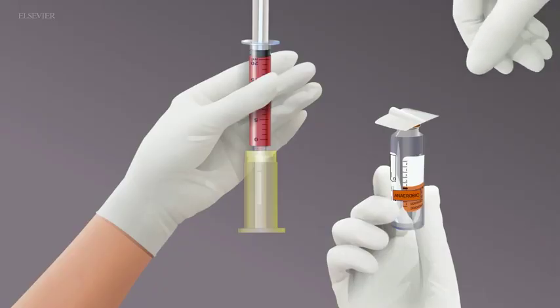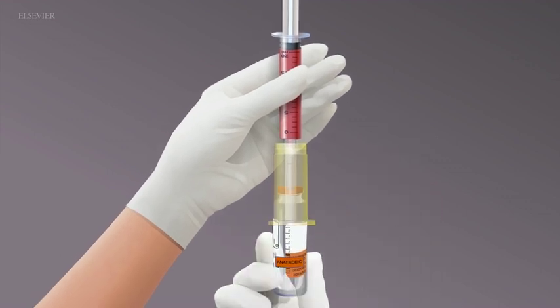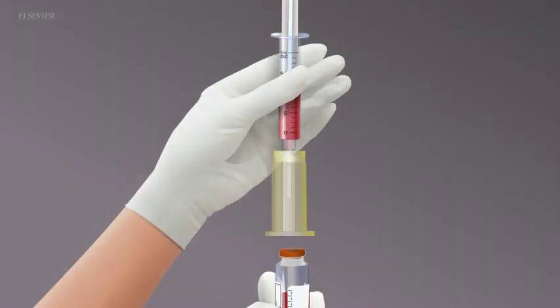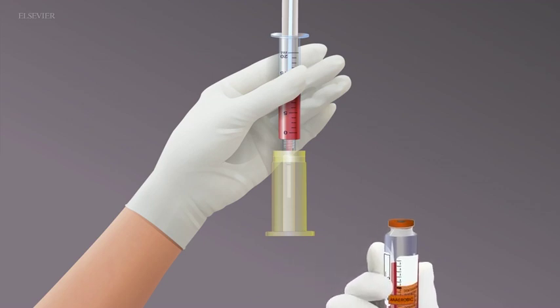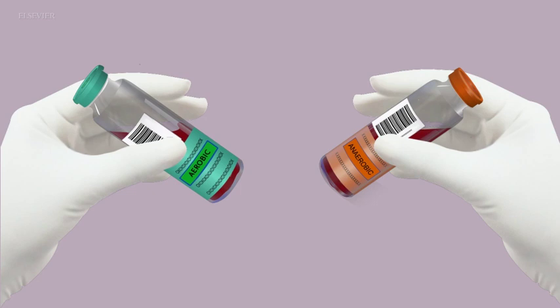Keep the bottle and syringe upright and inoculate the prepared anaerobic culture bottle first, ensuring that no air is transferred from the syringe into the anaerobic bottle. Inject 10 milliliters of blood into each bottle. If a second set of cultures from the CVAD is required, repeat the procedure from a second port. Gently mix the culture broth and blood in the bottles.